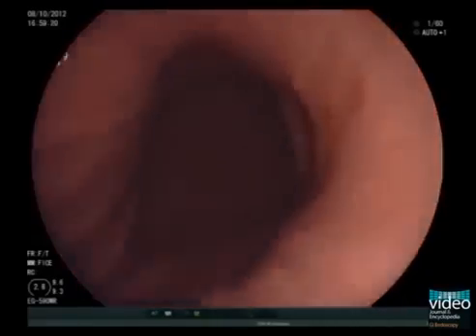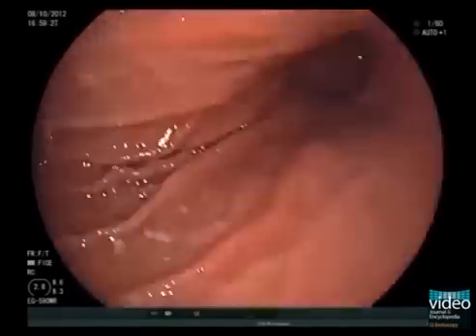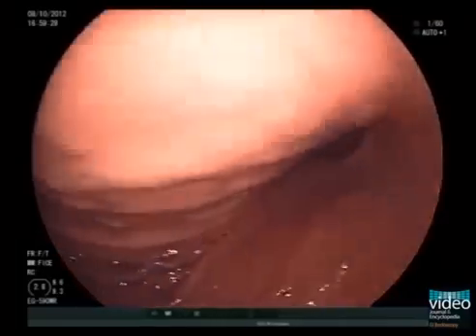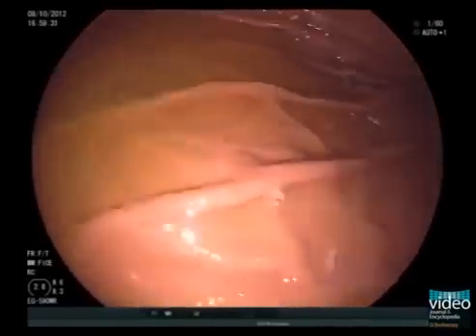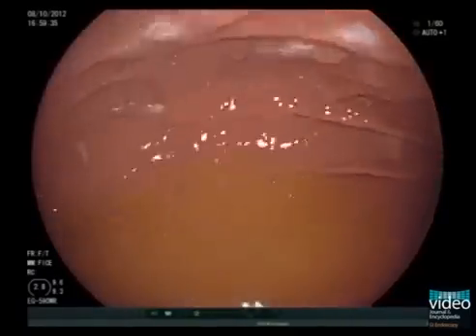Within the gastric body, continue the arc-like movements until the junctional area between the body and the fundus is reached. This is recognized by the appearance of the gastric lake, which, due to the elevation of the patient's head, is seen in the distal fundus just above its junction with the body.